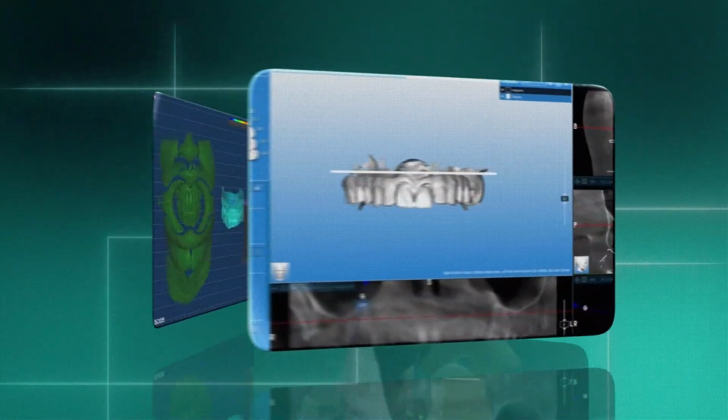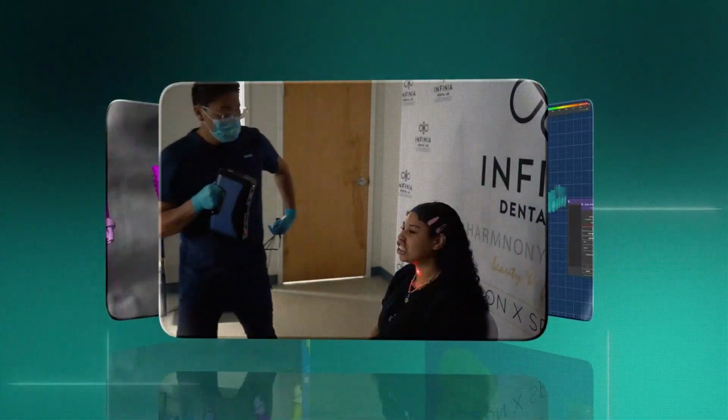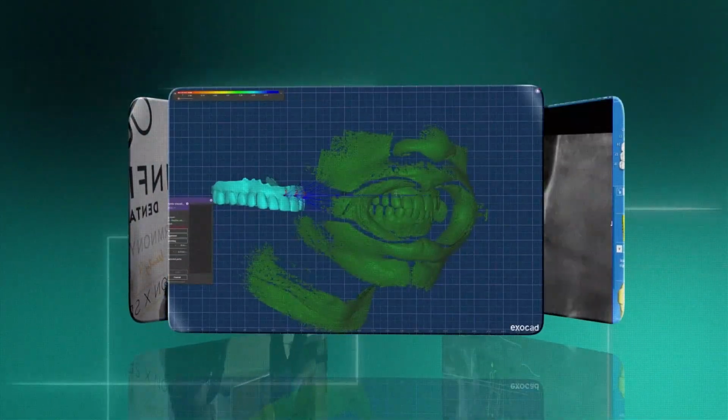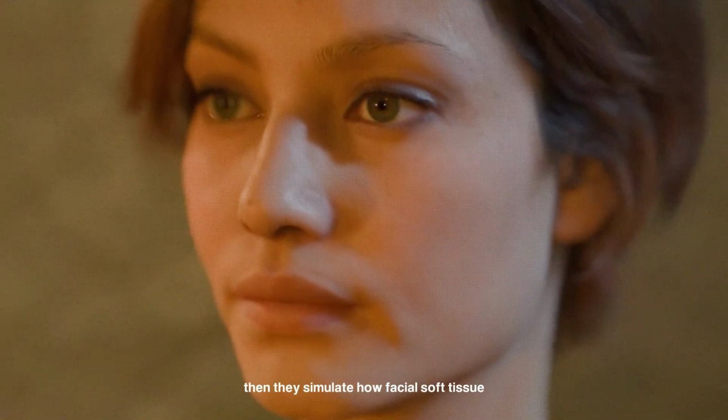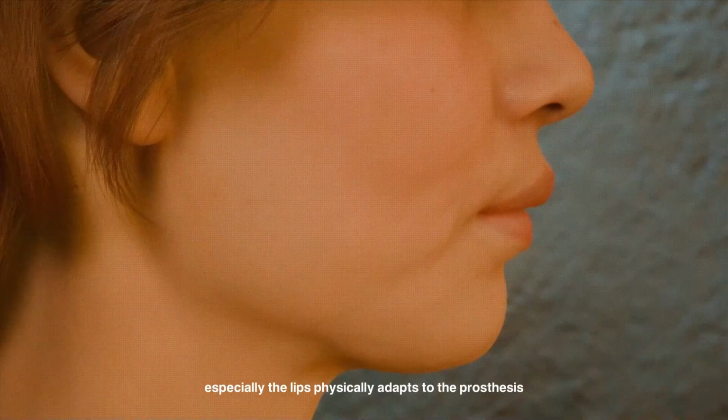So here's what they do. They build a virtual patient by combining intraoral scans, lab scans of the prosthesis, and 3D facial scans aligned into one coordinate system. Then they simulate how facial soft tissue, especially the lips, physically adapts to the prosthesis.